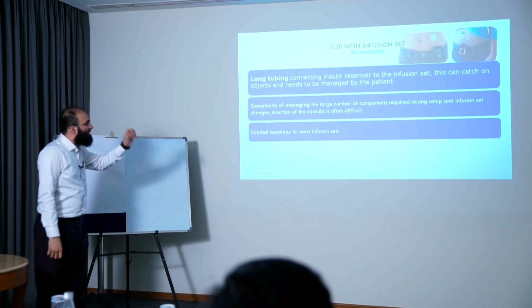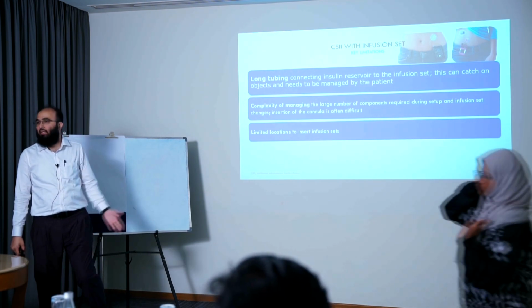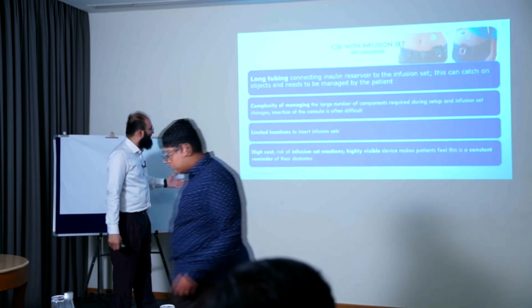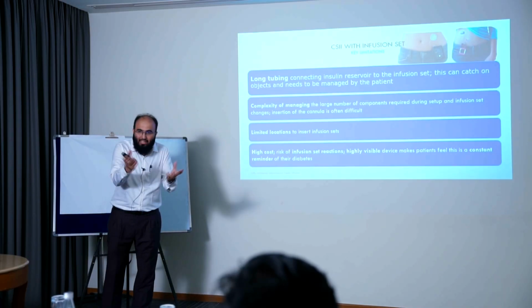Limited locations to insert infusion sets. Infusion set, you can put it here, you can put it here. Maybe if somebody is pregnant, thigh pe laga do, etc. Cost is a factor. Risk of infusion set reactions. Highly visible device makes the patient feel this is a constant reminder of their diabetes. Many patients might not know, many people might not know what a pump actually looks like.